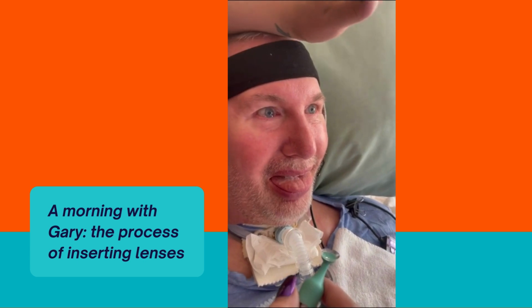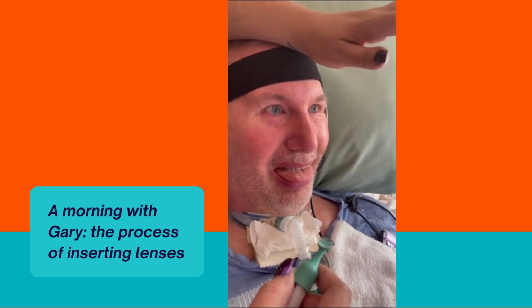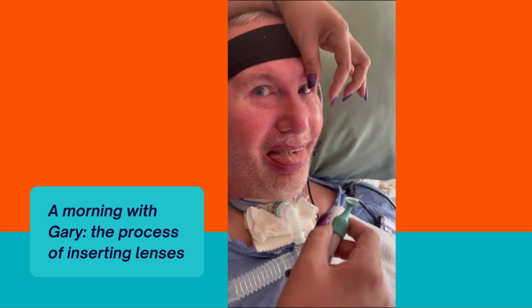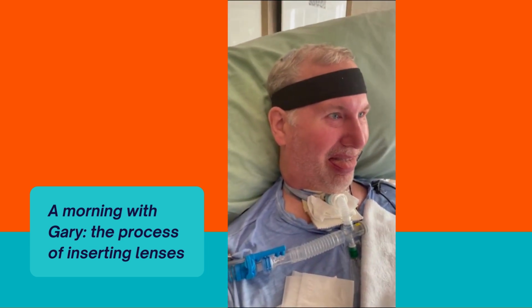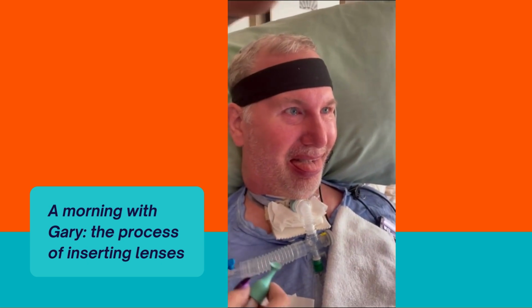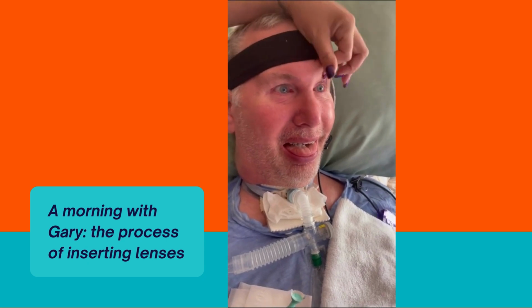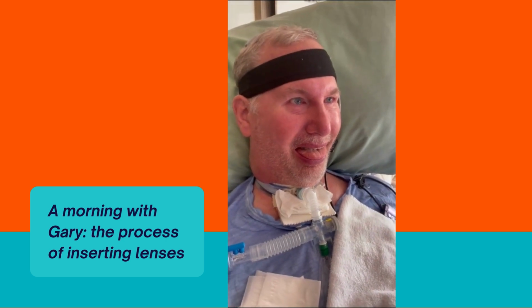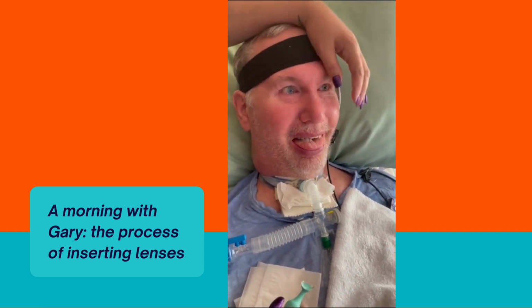So first, Gary's laughing. First, I put my arm on the top of his head, and it's just a little control to hold his head back a little. Don't, oh my gosh, Gary, we're making a video. Don't do that. Bernadine does not like when Gary gives her the eyeball. Okay, and we're gonna crawl up. Stop, Gary. Okay, you two goofballs.